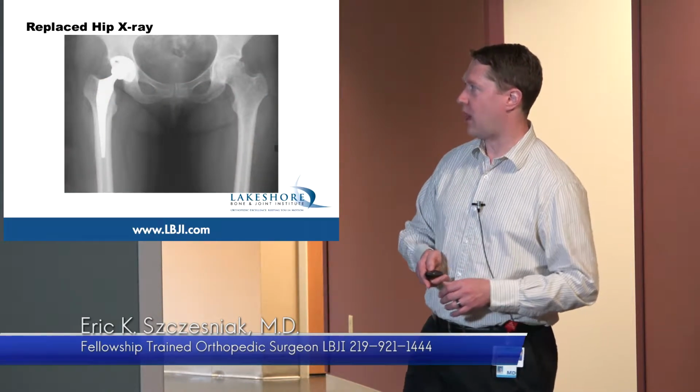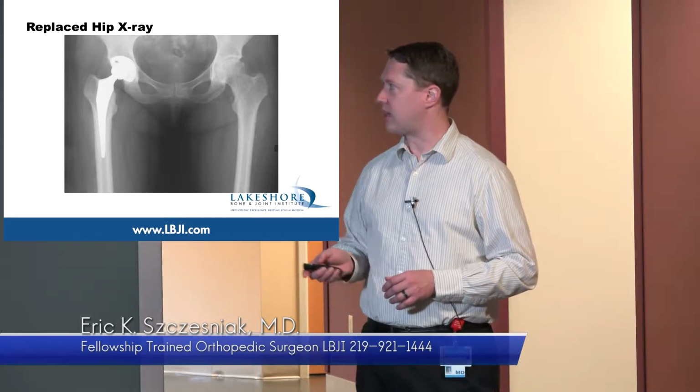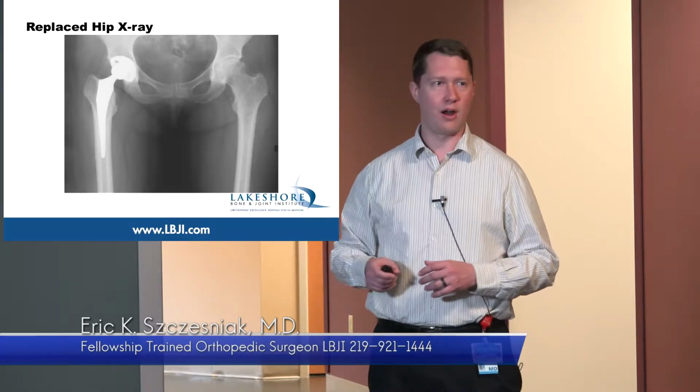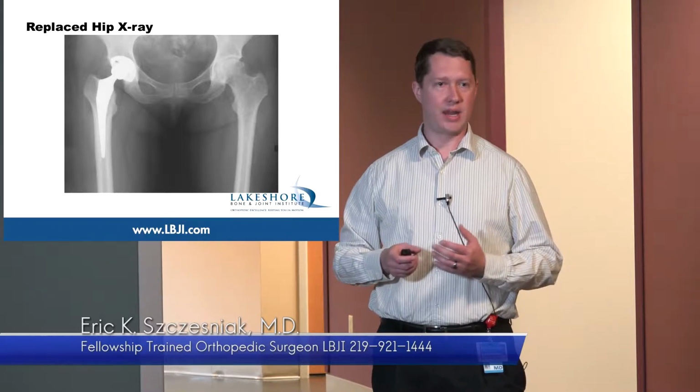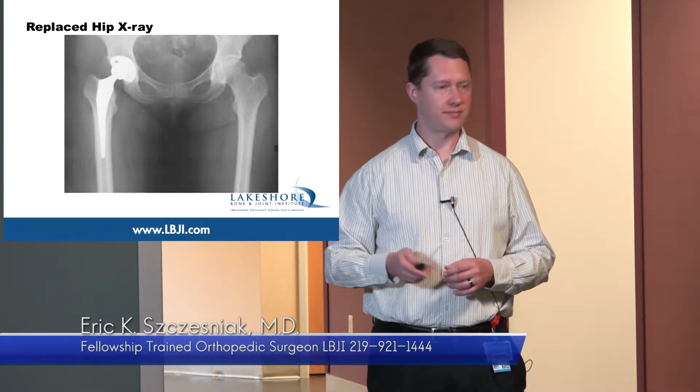On x-ray, it shows a little bit more of these foundation parts that are in the bone. The simple version here is that even though it's only the ball and socket that are worn out, we need to be able to mechanically hold those parts in the bone, so we have to use a foundation part that goes a little bit further into the bone.